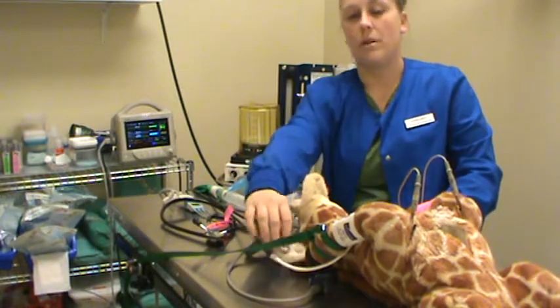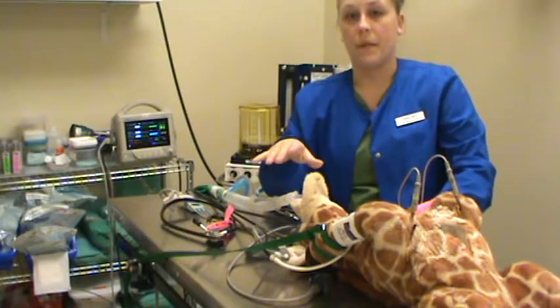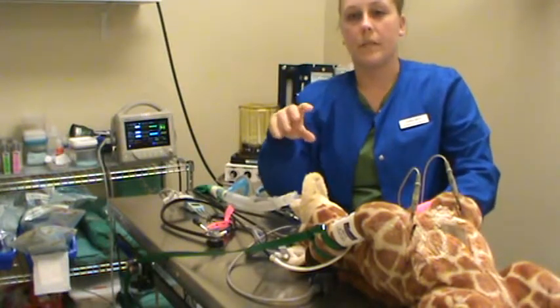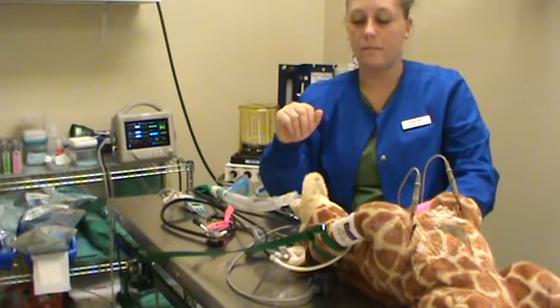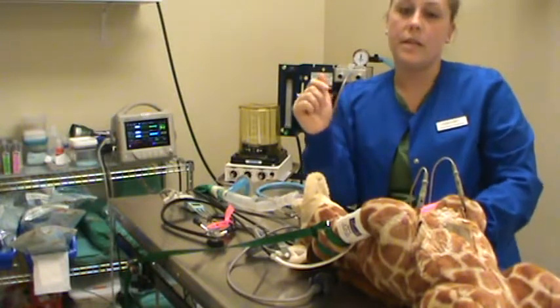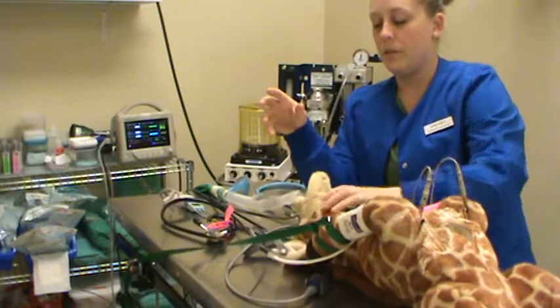This one likes to fall off a lot, the SpO2 clamp, so I'm going to check my monitors and be checking my patient's other vital signs, just to be sure that it's a mechanical failure and not the patient actually having distress. So last part of this video, we're going to go over the stages and planes of anesthesia and how they relate to the patient.